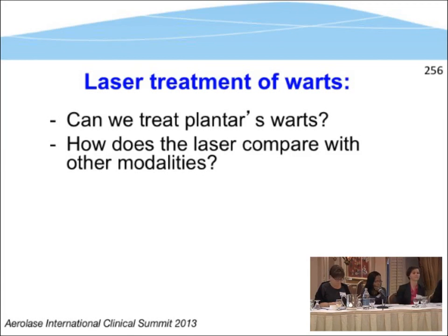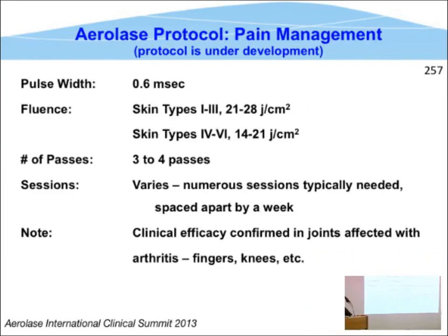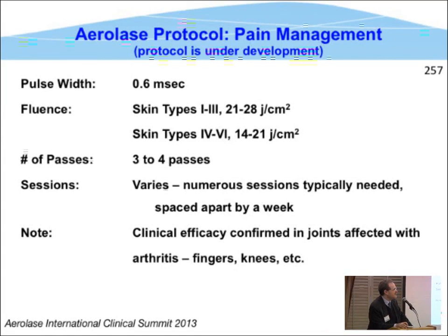Okay. Let's see. Don't hear the bell yet, so we'll keep going. Okay. Pain management. Pulse width, 0.6 milliseconds, 3 to 4 passes. Shows the number of joules up there. Numerous sessions typically needed, spaced apart by a week. The clinical efficacy is basically joints.